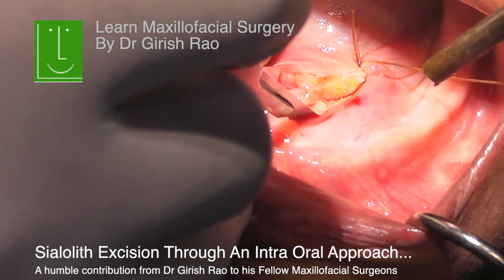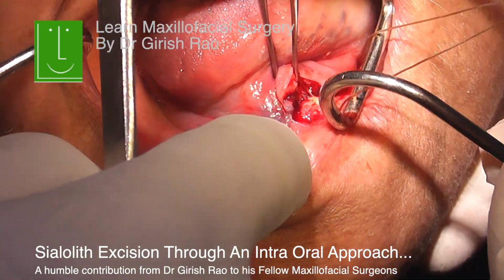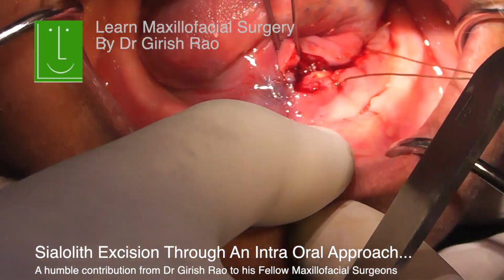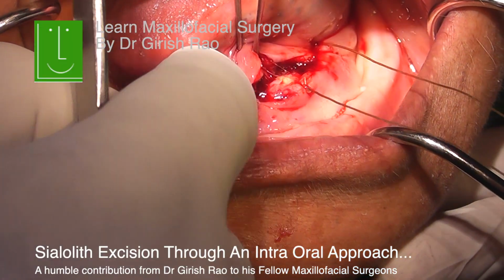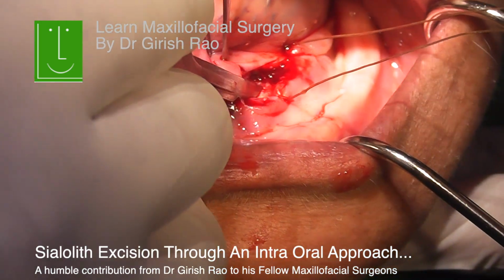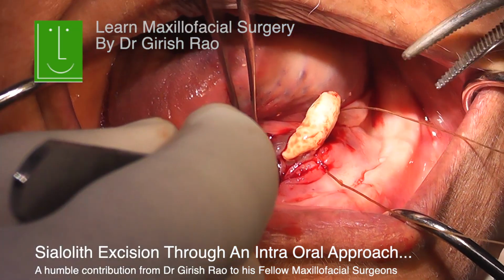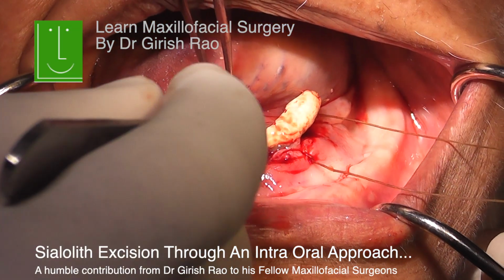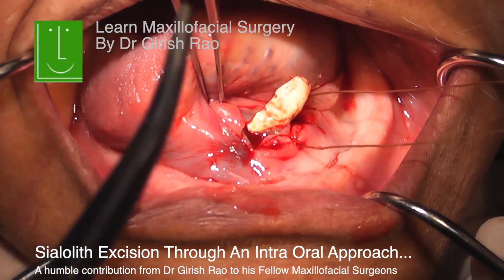So that is where, parallel to the duct in the floor, you make your incision using a 15 blade, and you need to ensure that you can palpate the stone, feeling as you go along. There you can see something which looks like a stone, and once you see that, you can just make a nick, and without any effort you can see the way in which a large stone has just popped out.